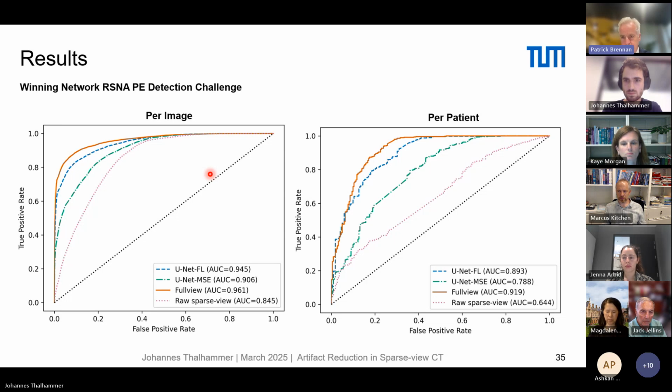It'll find the lesions, but it introduces so much stuff into the image that the specificity is much lower than mammography. I'm wondering if you could see that same effect here. Yeah, I agree. Doing a reader study would absolutely be interesting. Maybe when I'm back in Munich, I'll have time to bring these images back to the clinics.